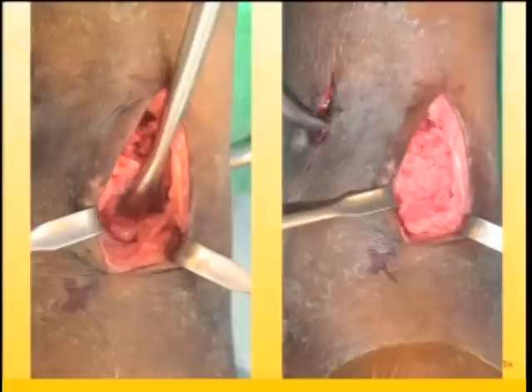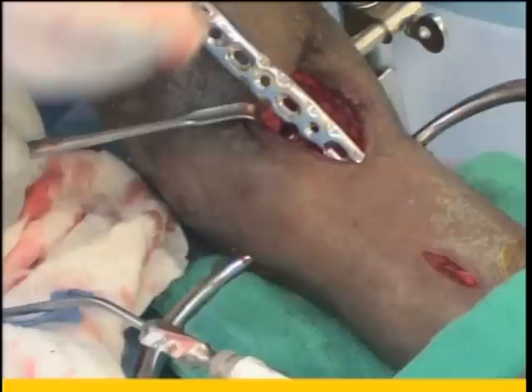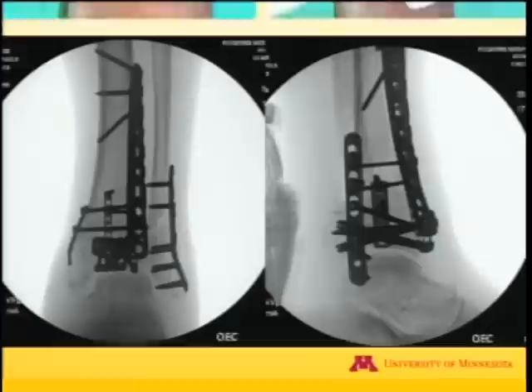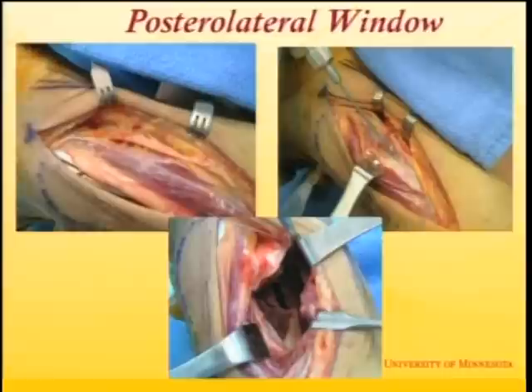So through that window, you can accomplish, if you understand these things and the reduction techniques that were just described in the past lecture, to bone graft appropriately in the metaphysis, apply provisional fixation, address the anterolateral impaction, which is so common, and then in this case, I've used an anterolateral plate, the anti-varus plate, through the minimally invasive incision that Sean talked about, and a respectful technique for soft tissue closure, as we have all learned, yielding this ultimate fixation. I'm a fan of the posterolateral window as well, and I fix every posterior malleolus fracture as well.